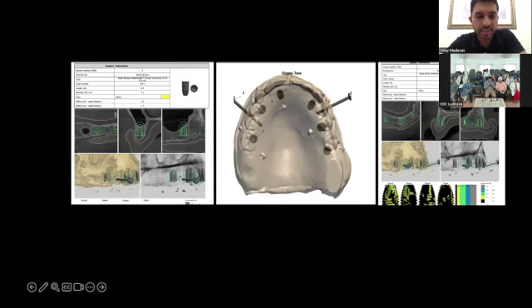So if you look at this picture on the left side, as you can see, this is a CT scan that's actually obtained with an existing denture. And then with the markers, you go ahead and merge it. And this is an implant planning. We use 3Shape. We have a couple of different software, Blue Sky Bio, 3Shape, Exoplan, whatever it is, you can go ahead and use those. So what I'm seeing in this scan here is this is where I want my implant to be.